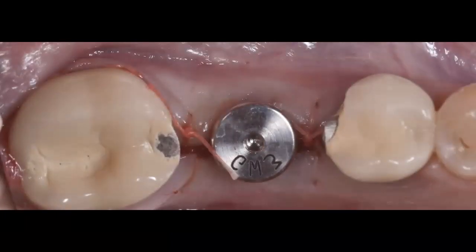And this is a BioHorizons implant that I chose for this patient, and you can see this is immediately after the surgical procedure was completed, with that same guide that I just shared with you. So the guide helped me have full control of my surgical field, and I was able to make this guide myself in-house. So that would obviously reduce my cost.